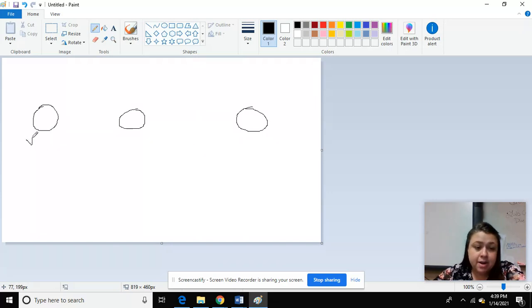So I'm going to make this antibody look like the antibody from your previous assignment. Looks like an A antibody. And if this antibody attaches to the cell, that will cause 1, the blood to thicken. So that's how we know it attached. And 2, it'll let us know that she does have A antigens on the surface of her blood.